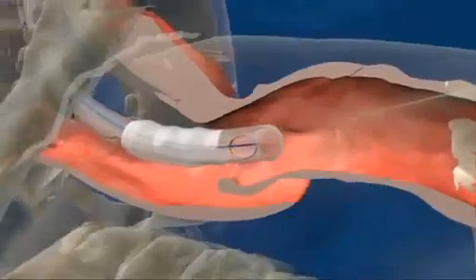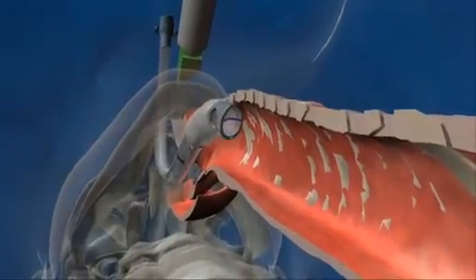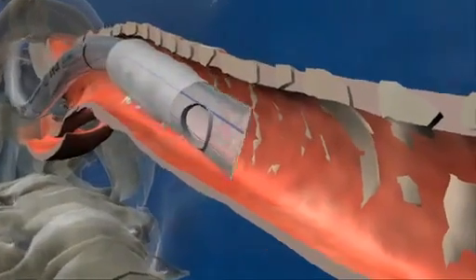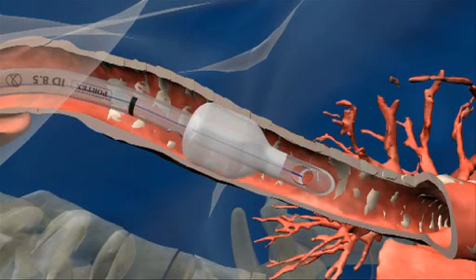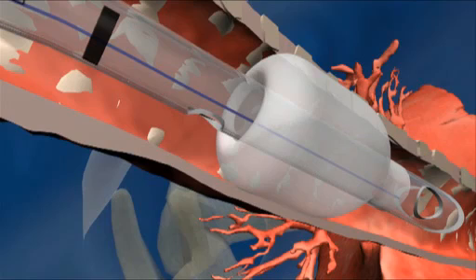With the vocal cords visible, gently pass the SACETT through the vocal cords into the trachea until the intubation depth mark is at the vocal cords. Connect the ventilation system to the tube and inflate the cuff with the minimum amount of air to provide an effective seal. The cuff pressure should be regularly monitored and maintained between 20 and 30 centimeters of water, for example, using the Smith's Pressure Easy device.